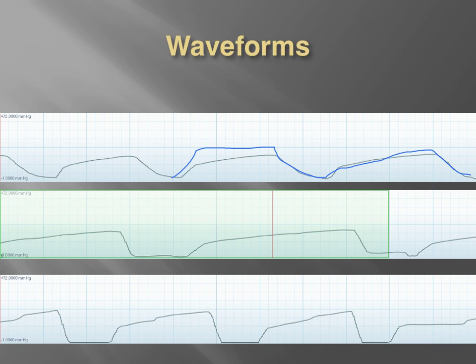They're just not. Okay, if we get into that alpha angle thing, which we don't want to get too far into, right? Normally we're about 110 degrees. We can definitely see that this alpha angle is much, much more profound and probably at least 140 degrees. Okay, so abnormal waveforms, and this would be indicative of delayed exhalation.